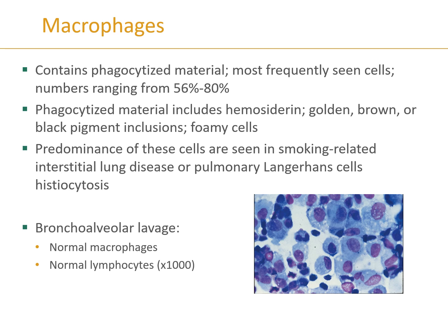In this particular image right here, you can see a lot of these larger cells that look like really, really large fried eggs. Those are just normal macrophages. They're just there at the ready to digest anything that could present down into those lungs, any kind of viruses, bacteria, anything like that, to try to contain it and dispose of it before it becomes a problem. And then of course you have the normal lymphocytes that are a little bit smaller in between some of those larger cells, so you can see an image of those.